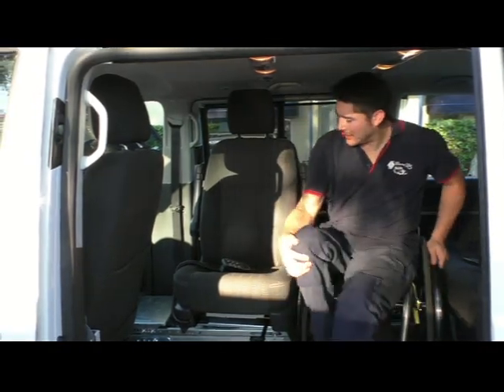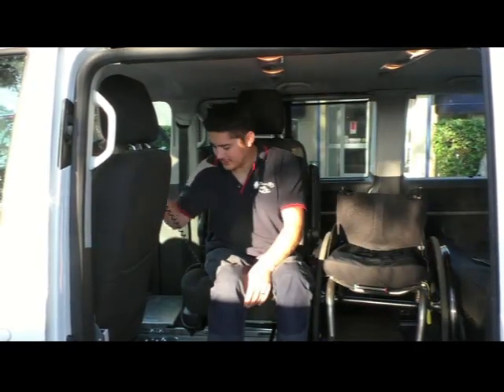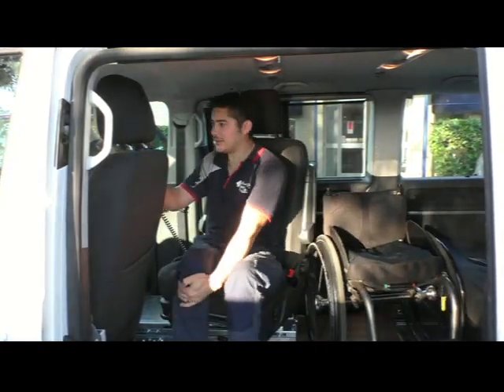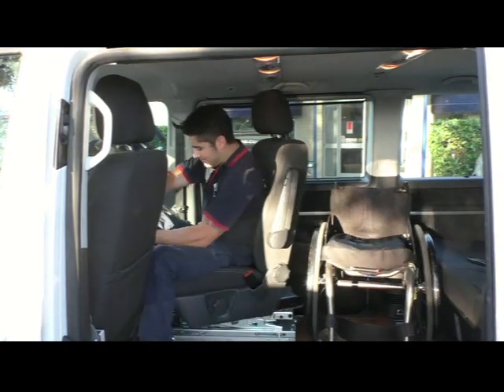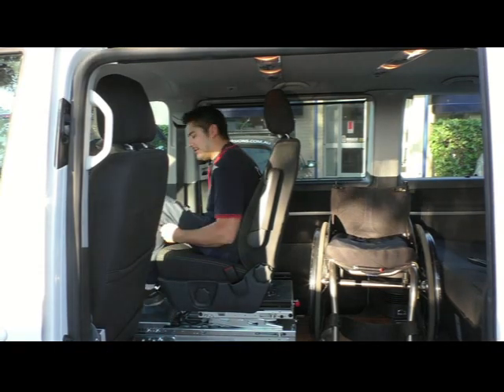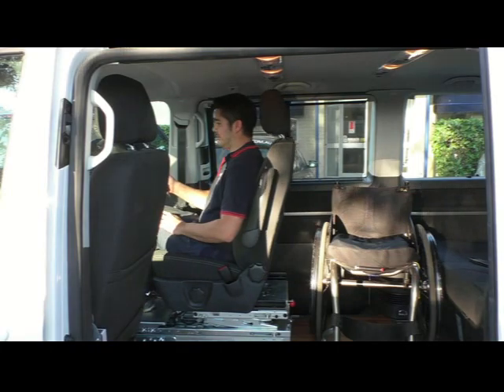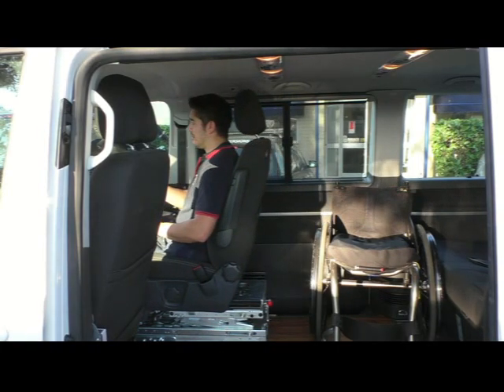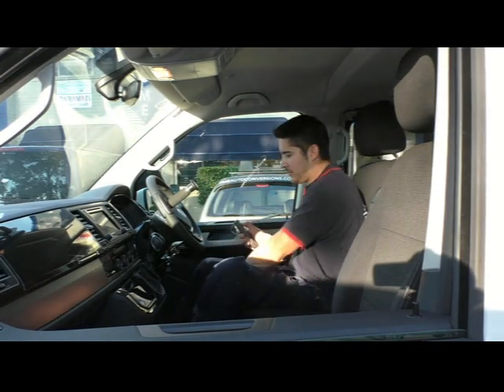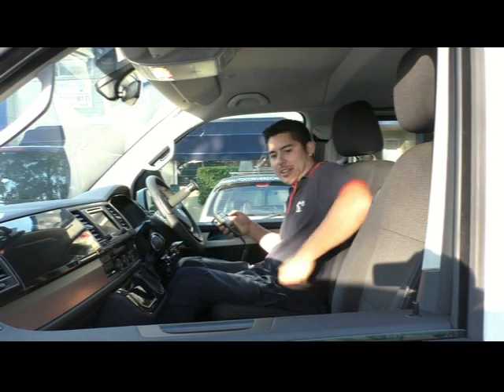Now we get into the driving position here — the transfer — and then we just come around with the seat base. Check the length on the board here and then come forwards into the driving position. There you go. Now you're in the driving position. It's that easy.